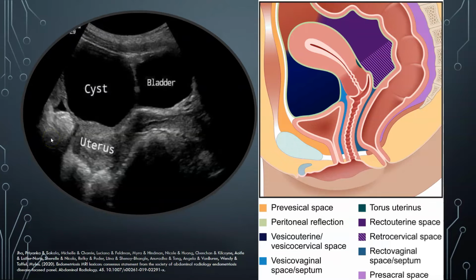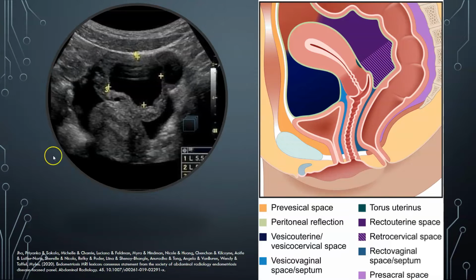All right, so this is that other case, another large ovarian cyst. Maybe we should make that a sign as well in the bonus round. The ovarian cyst-to-cyst sign, that's too many words. All right, so you got a bladder that's not very full. Here's your vaginal canal, here's your uterus, fundus, and this large cyst that ruptured during scanning.